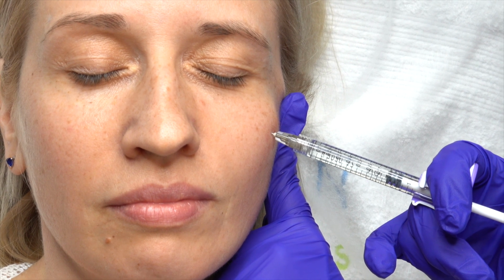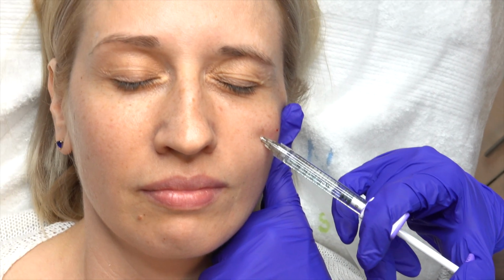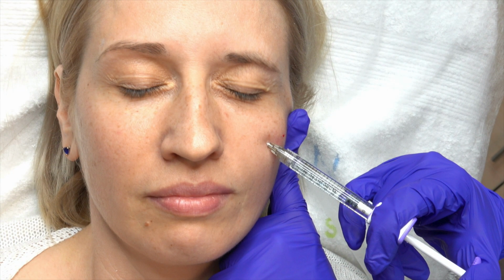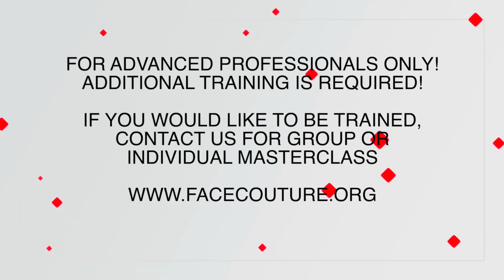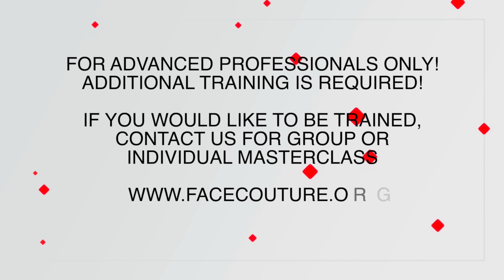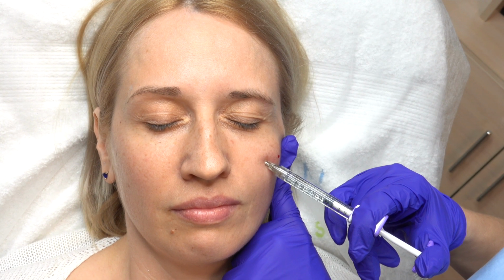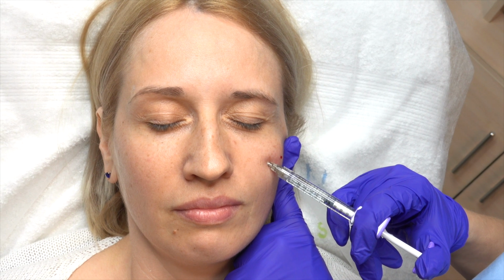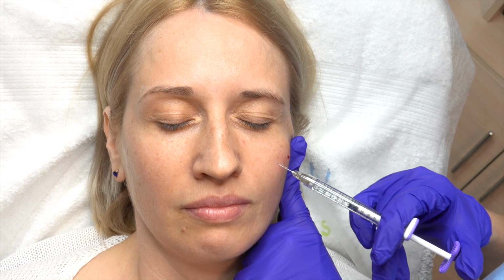That's great. Done. And now I go to the midcheek groove, and here I am injecting on the bone. And also 0.2. And we're done this side.